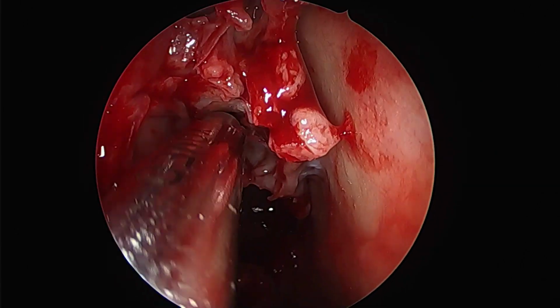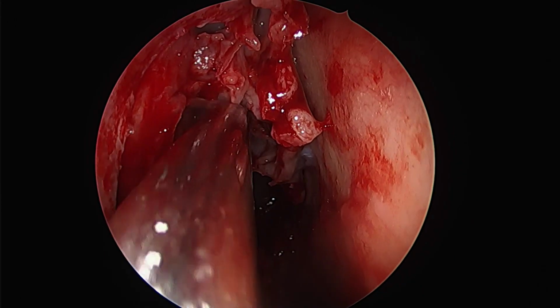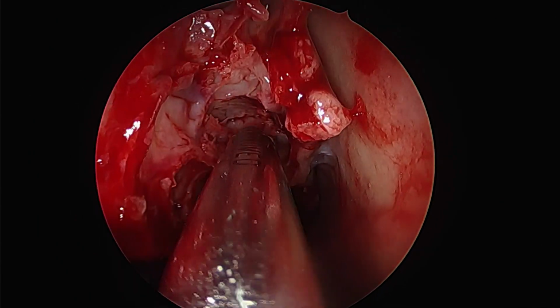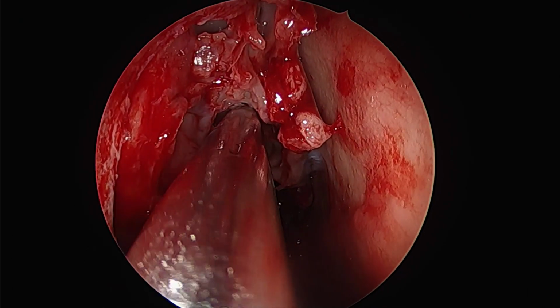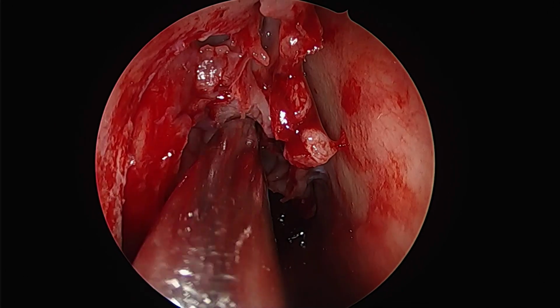So as we can see, the meningocele is still visible, medial to the middle turbinate, slightly posteriorly on the cribriform plate, and we are just right now completing our ethmoidectomy and opening all the ethmoidal layer cells to identify the skull base.